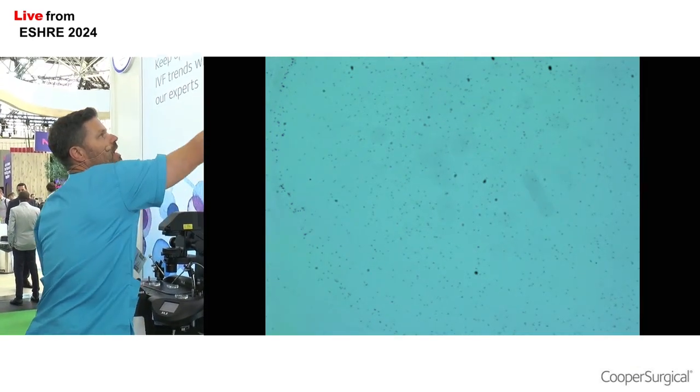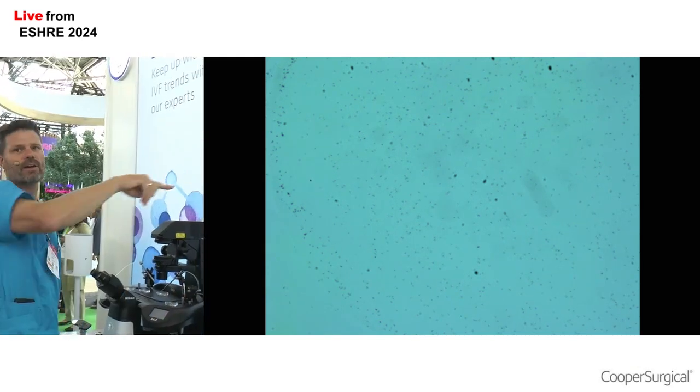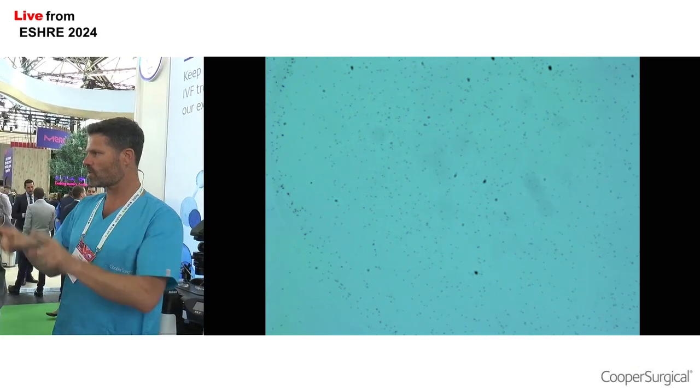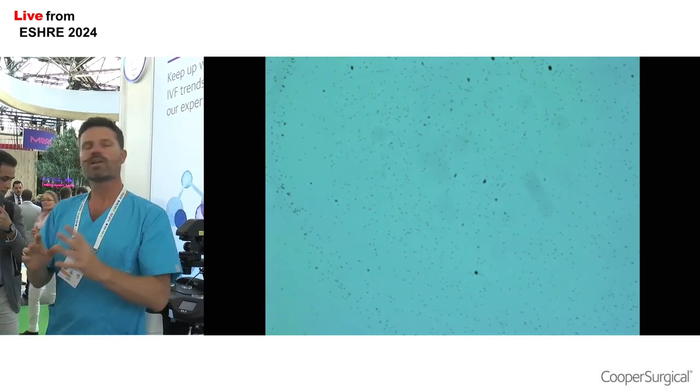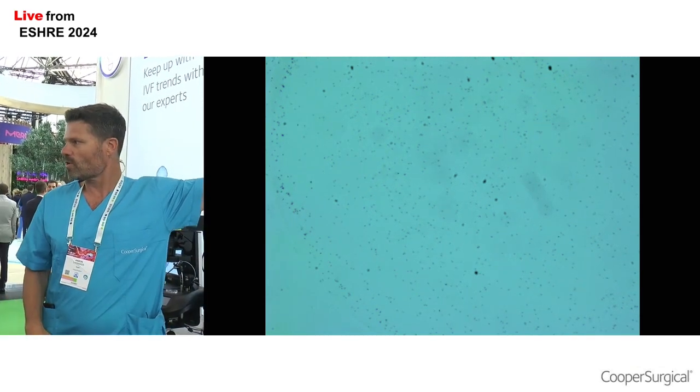Can everyone see there's a kind of a circle here? It's going around there. This is the area where the hyaluronic acid is on the dish. Okay, it's in this circle within that drop that I've created. So what we're going to do is we want to select sperm from within this zone here.